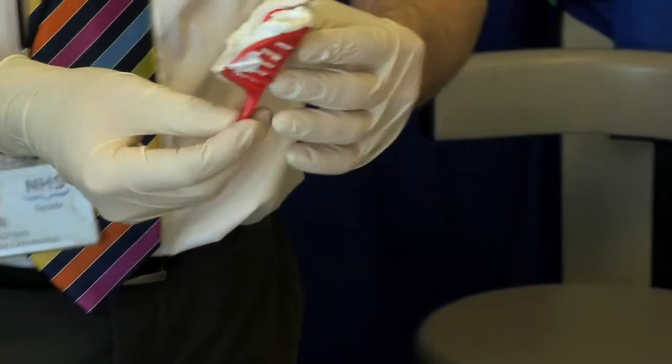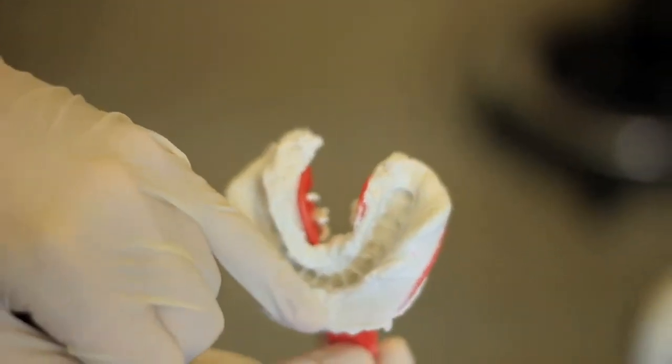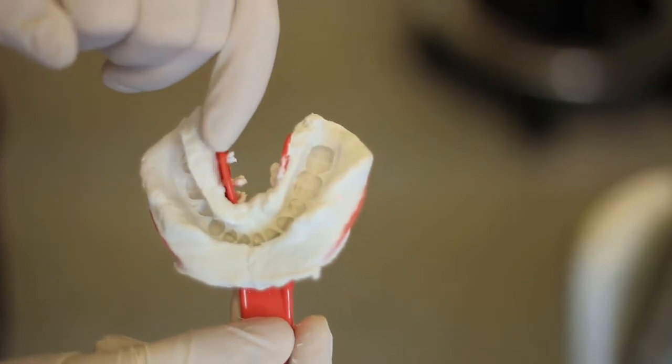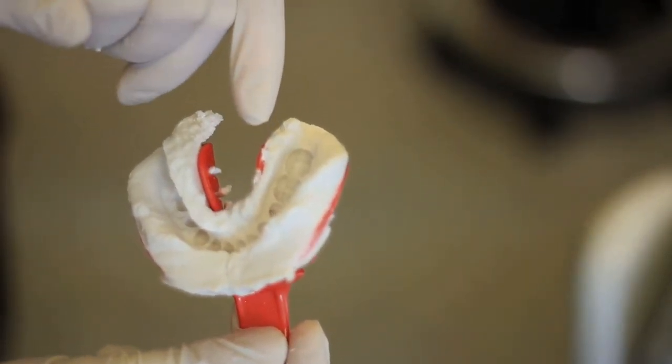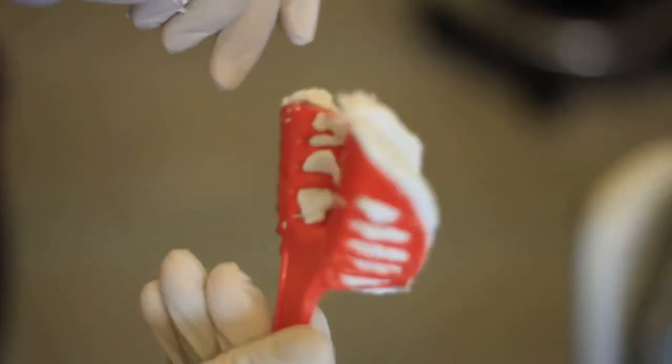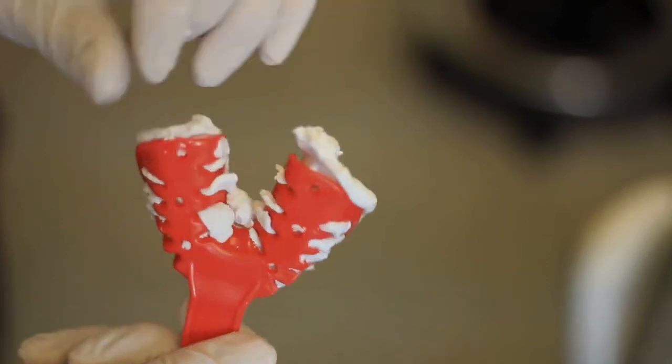Have a look at that. And unfortunately it's not a very good impression because we've got some air bubbles all around it, and we've missed some of the area down the lingual sulcus near the tongue, and unfortunately the impression has started to come away from the back because we didn't take it out properly.